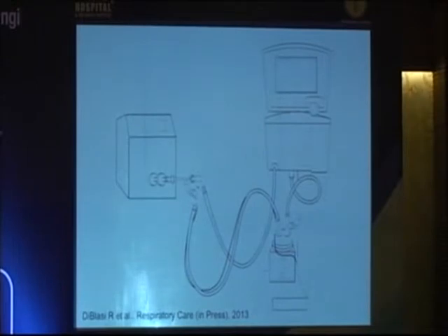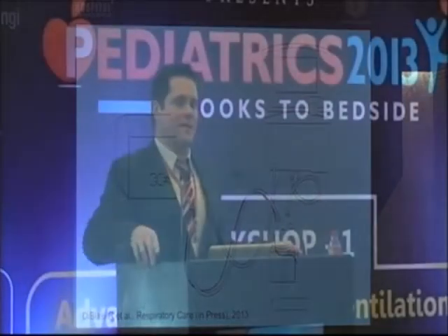We only believed that the only way you can provide this drug was during conventional ventilation or in a spontaneously breathing baby. Most of the babies that we tried to enroll into the study were receiving high-frequency oscillatory ventilation. So we said to ourselves, well, you can't give inhaled drugs with an oscillator. We still don't understand the complicated fluid dynamics of how a high-frequency oscillatory ventilator operates. There's a tremendous amount of resistance, short inspiratory times. There's no way that you're going to get any drug into the system, so we never enrolled anyone into that study. And so I took it to the lab and I said, well, there might be a possibility that you could get some drug delivered to the lung when you're using high-frequency ventilation.